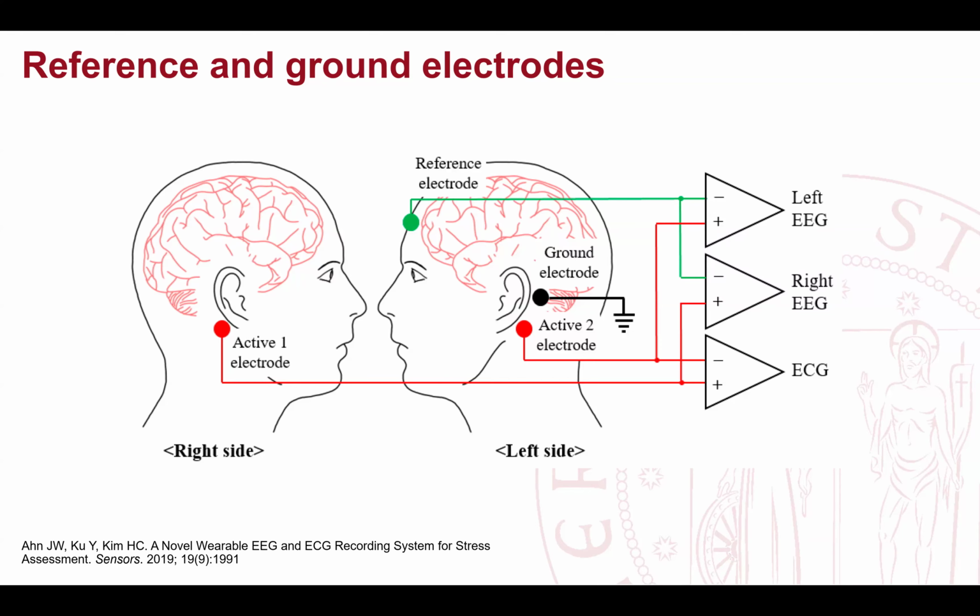What you measure is the difference between your EEG electrode and the reference. Normally you also have an electrode for the ground, which is used to collect all the noise and all the electrical activity that flows. The potential difference is measured by your electrode, and then all the current goes back to the ground and goes away. So this is the normal structure.